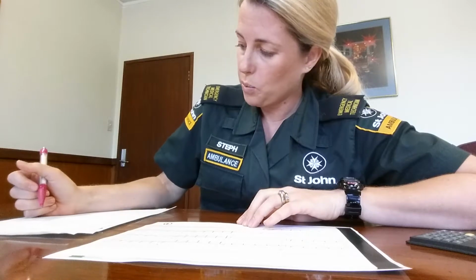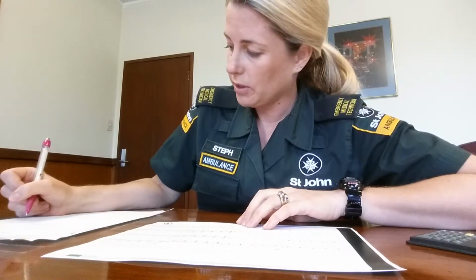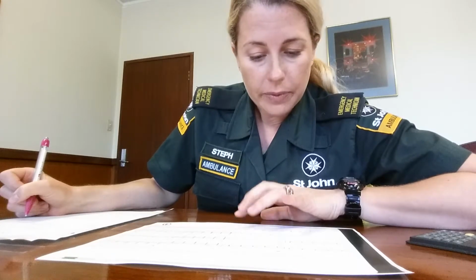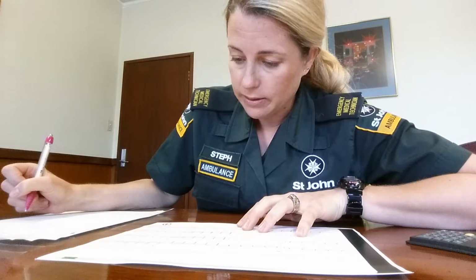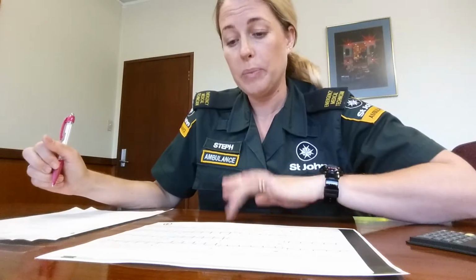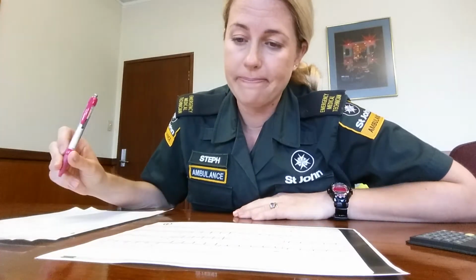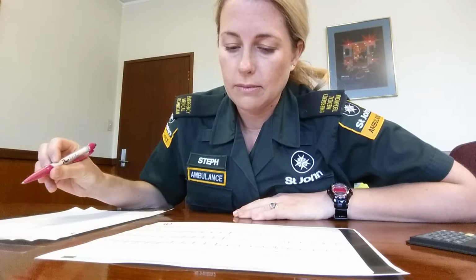So the interpretation will be sinus tachycardia is the underlying rhythm. We've got an intra-atrial conduction delay. Looks to be an inferior posterior STEMI with lateral extension. I'd like to get a V4R and a posterior ECG to confirm. So on your posterior ECG, you see 2 millimeters of ST elevation in V7 through to V9.